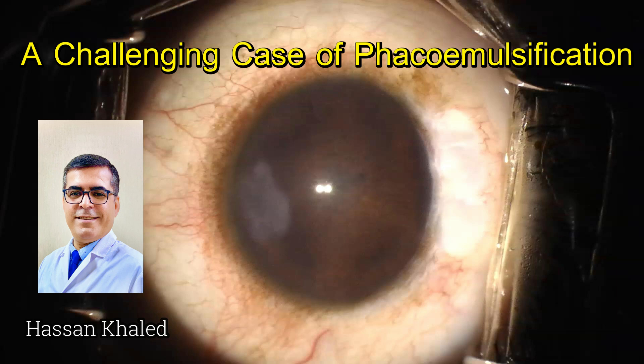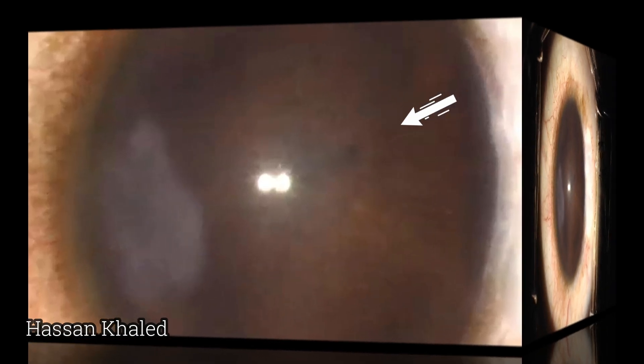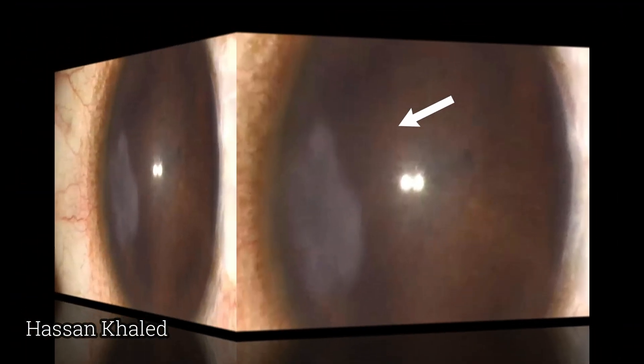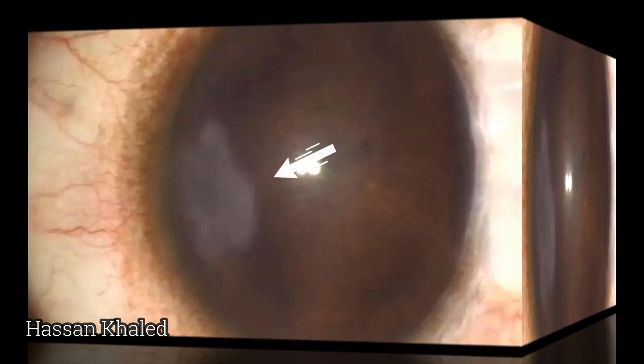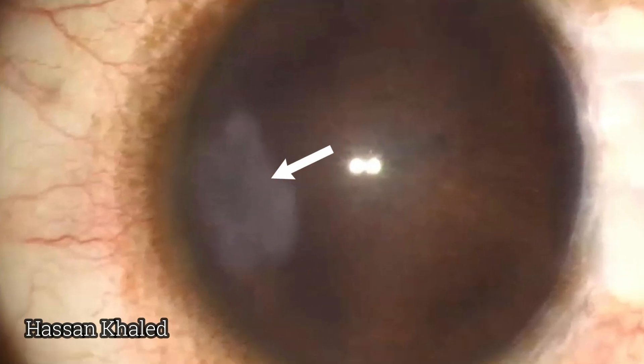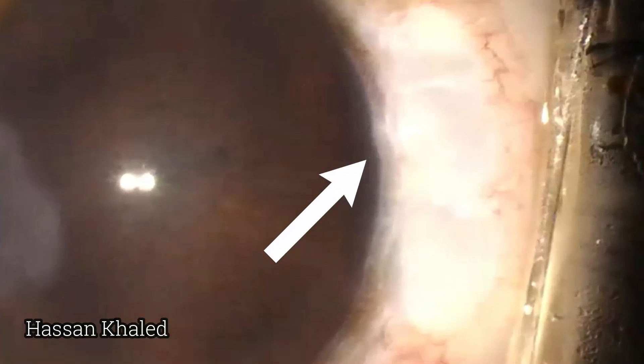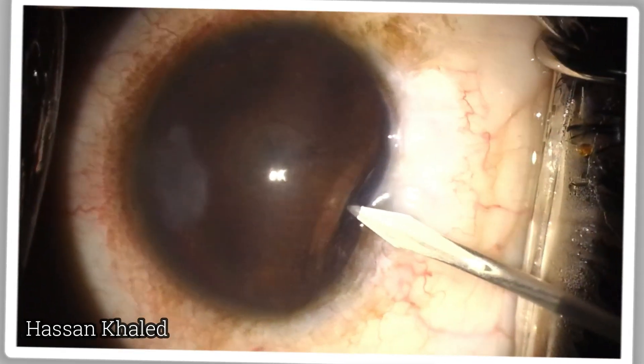Here is a challenging case of phaco-emulsification in an adult patient. As we can see, the pupil is totally obscured with the pupillary membrane, and there is a corneal scar in the inferior part of the cornea, together with a functioning bleb, as this patient had glaucoma surgery previously.